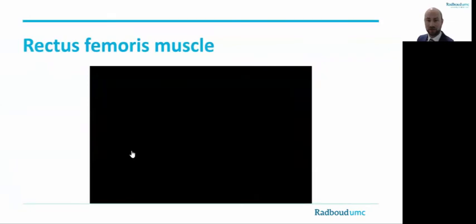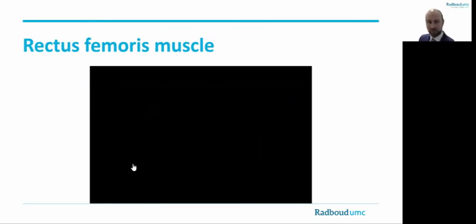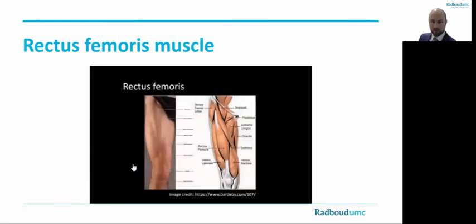Let's start with the first instruction video of the rectus femoris muscle. This is the protocol for scanning the rectus femoris muscle. The subject is in a supine position with the limbs relaxed. To standardize the measurement, we scan the muscle at the site of its maximum bulk. For the rectus femoris, this is halfway between the iliac spine and the upper edge of the patella. This position is marked on the skin.